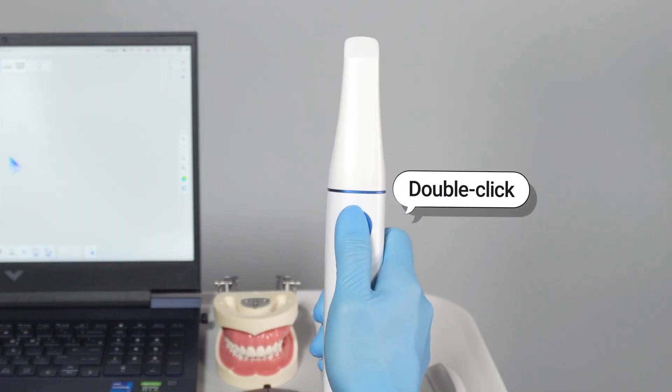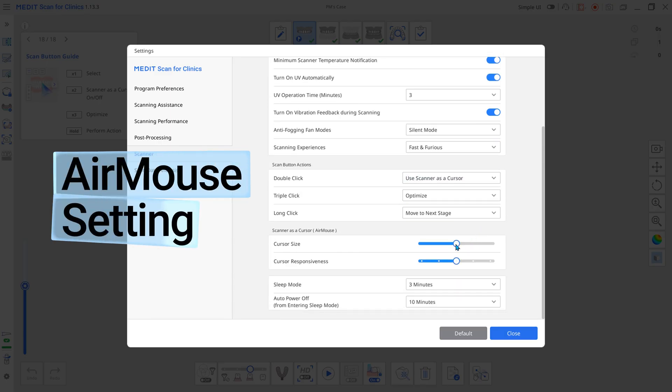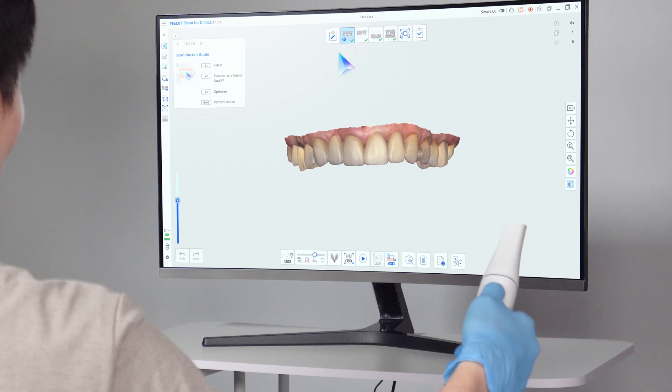Double-click the Scanner button to activate the Air Mouse, and you can change the click action in Settings. You can also adjust the cursor size and cursor responsiveness for your preference. Activating the option displays a mouse icon, allowing you to control data easily.